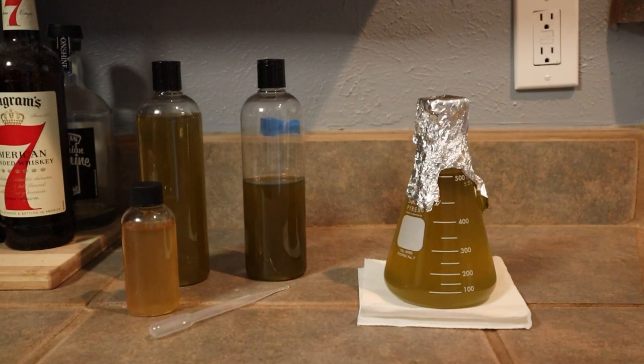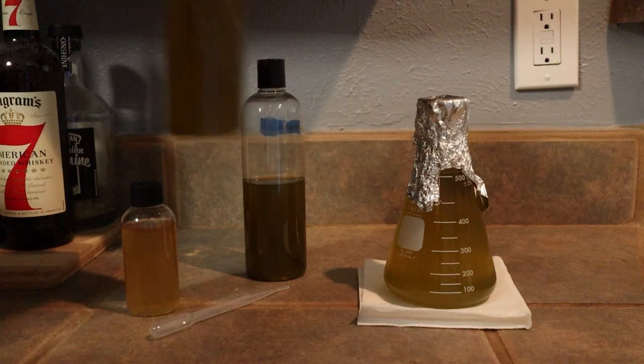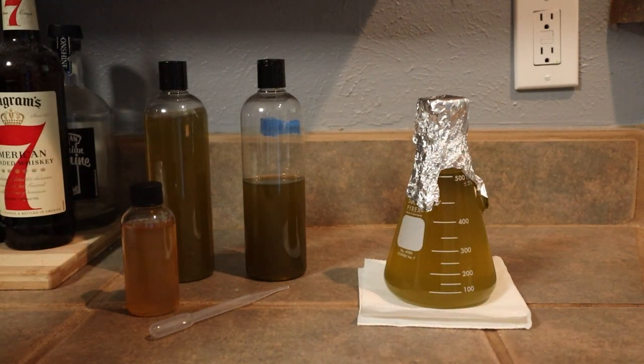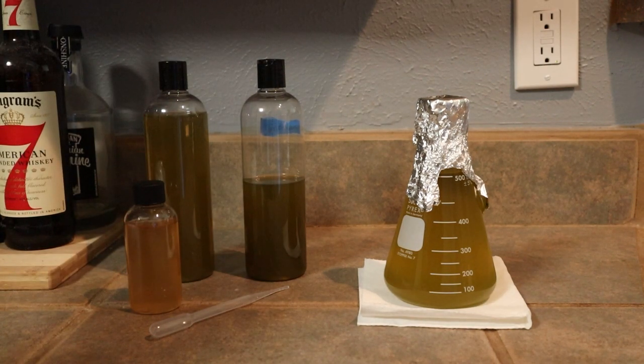Now if you were doing this for a gallon amount, I would add a full 16 ounce bottle of Isocrysis to your one gallon container, and I would also add three milliliters of F2 to that one gallon container.